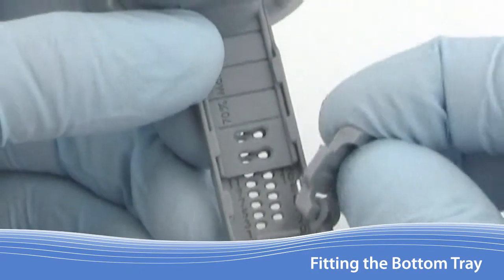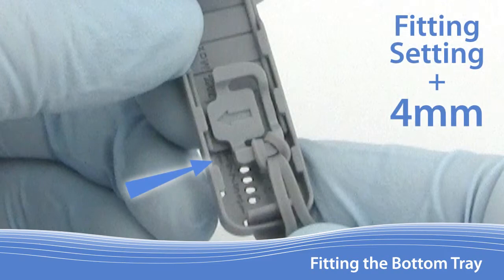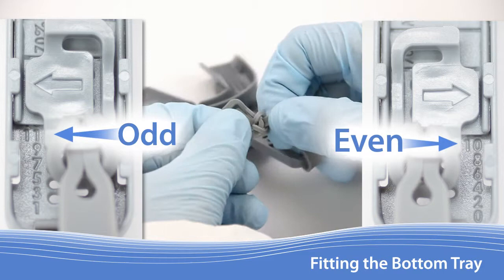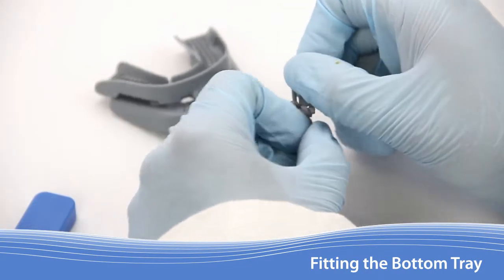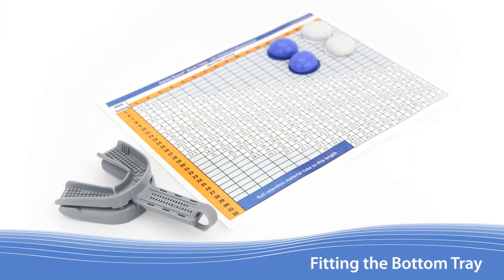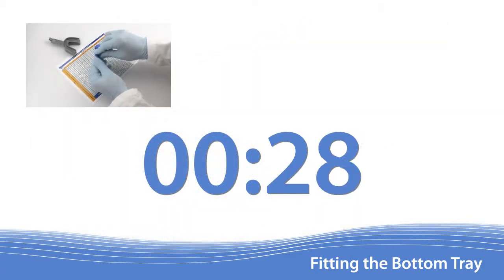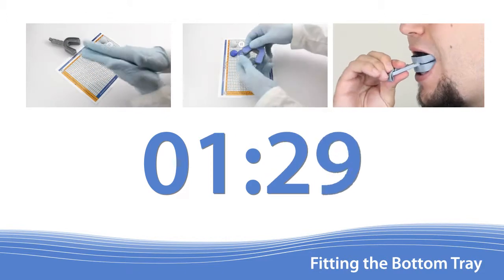To fit the lower tray with the retention material, lock the Apnea Guard into the fitting setting plus 4 mm. Using the previous example, the lock should be set at 11. The lock is designed to be bi-directional for either odd or even numbers. Adjust the tether to the end that allows the arrow on the lock to face towards the patient's fitting setting. With the Apnea Guard locked at the fitting setting plus 4, place the device on the work table with the bottom side up, as you will be preparing the bottom tray first. You will have 1 minute and 30 seconds to mix the material, distribute it into the tray, and insert the Apnea Guard into the patient's mouth.